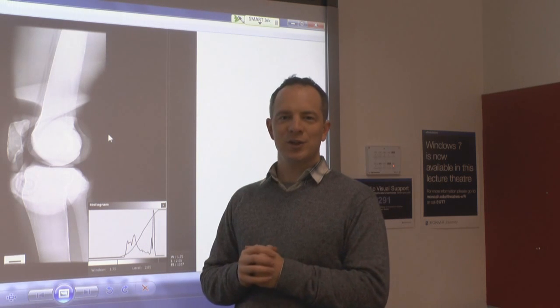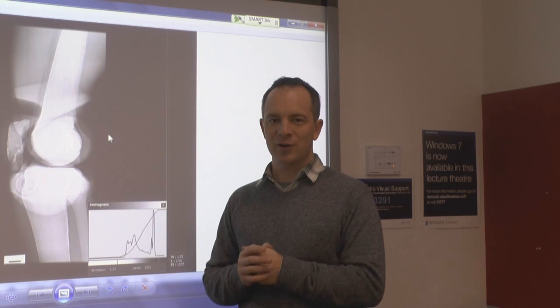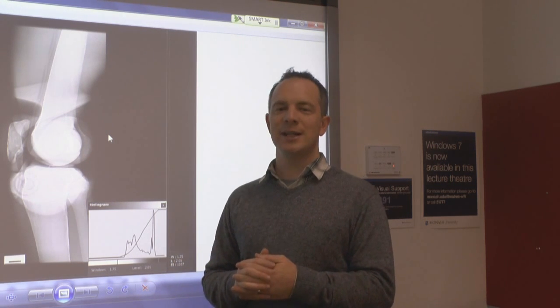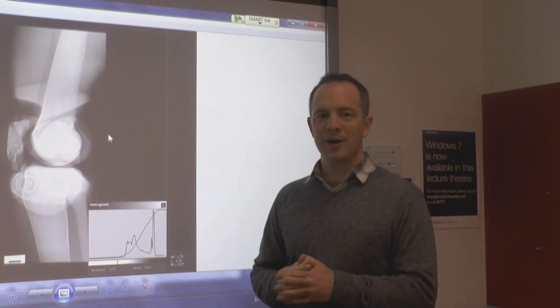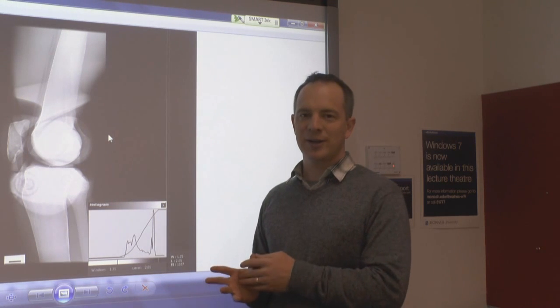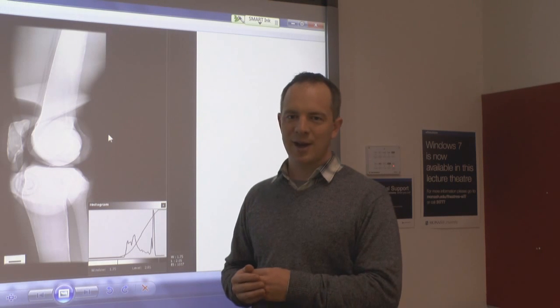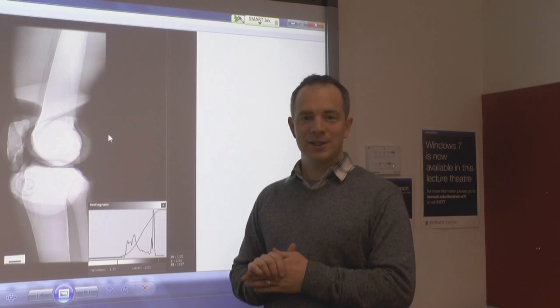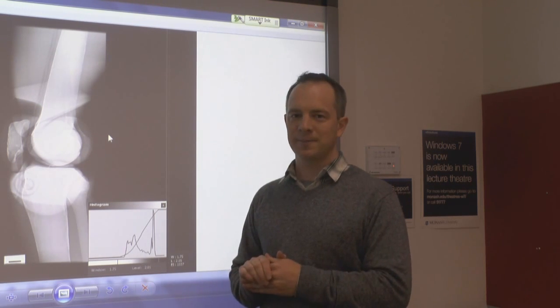So the International Electrotechnical Commission came up with a strategy of having a single algorithm that all manufacturers can use, and instead of the exposure index, they call it a deviation index. So that is something that you will see from time to time, and increasingly so in the future. But you need to be aware that still currently in Australia, many manufacturers still use the exposure index. And you'll need to have a chart that is relevant for that specific imaging system and also for the specific body part that has an appropriate exposure index.